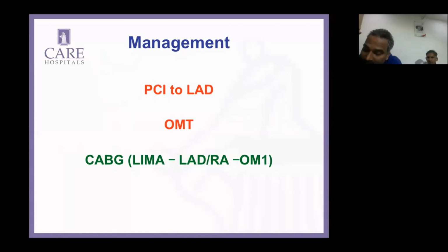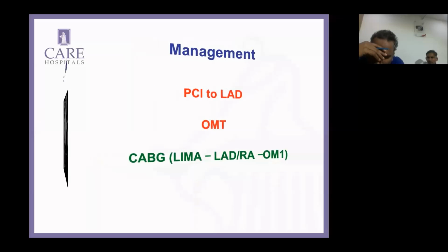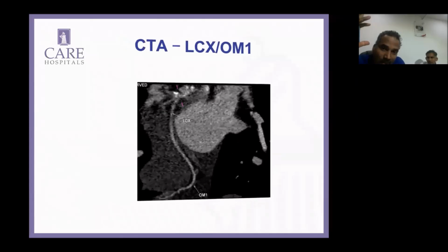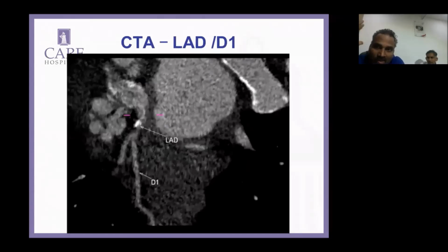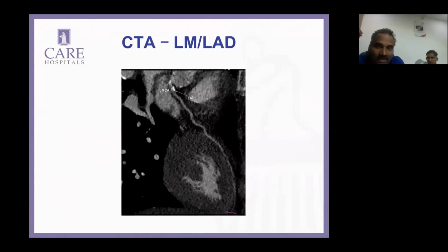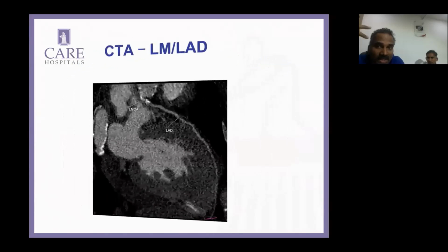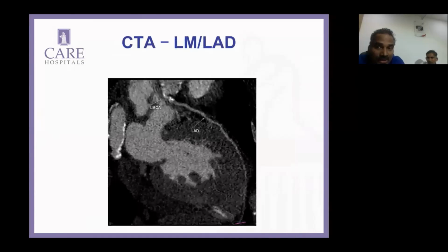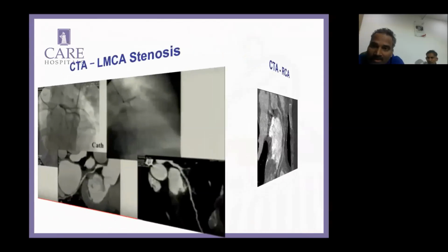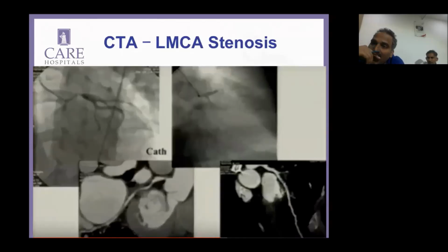So, obviously, in a patient where we are not able to see the epicardial coronaries properly, I would go directly to CT angiogram. Sometimes we may not be able to hook the coronary, many times the right coronary artery, due to abnormal origin. In these situations, rather than struggling in the cath lab, I'll do a CT angiogram.